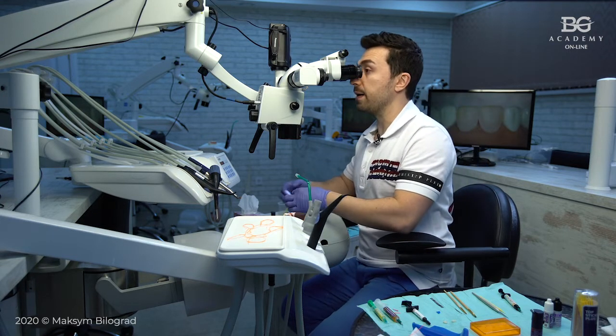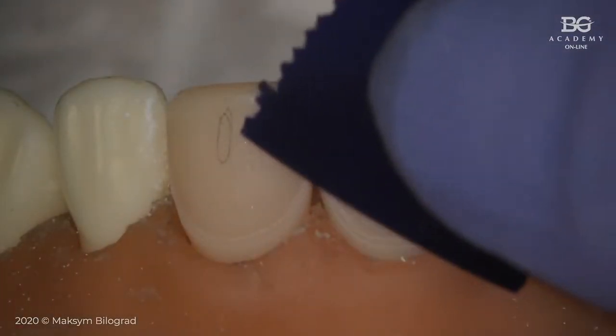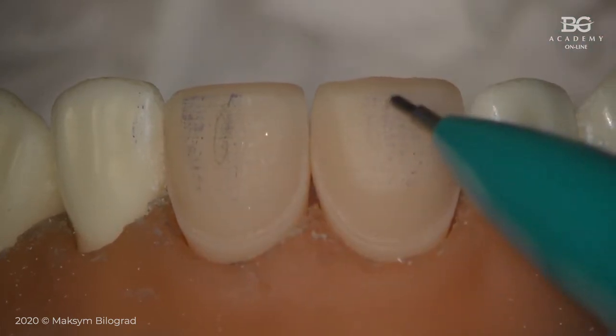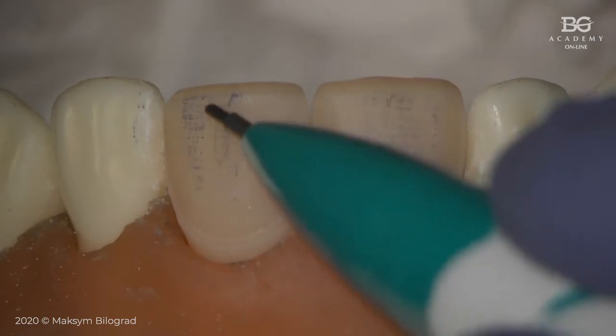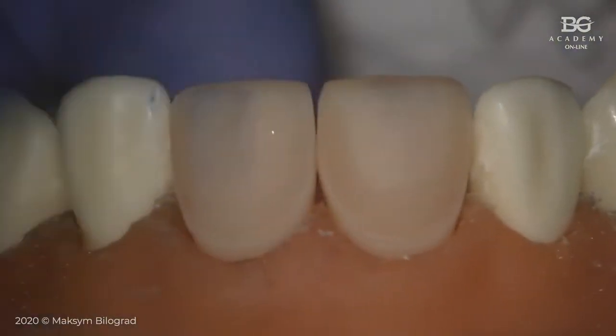You may take a thin articulator paper and just move your articulator paper like this from the cervical area to the incisal edge, and in the area where you have that small particle, the color of your articulator paper will be really intensive. So that will be easier for you to identify the small part of provisional veneer, and you can remove it with a multi-bladed burr. Okay, so this is a small tip. And then we go for try-in.